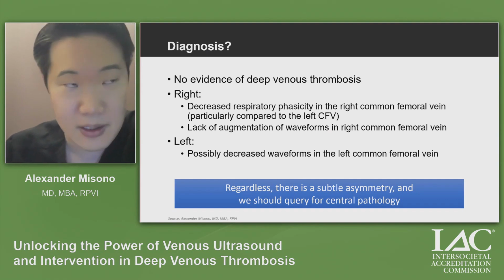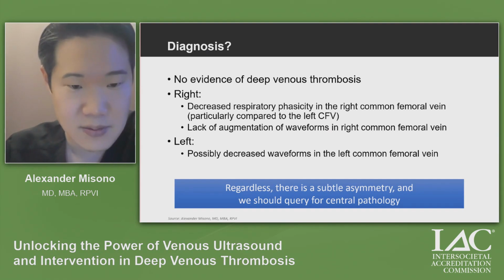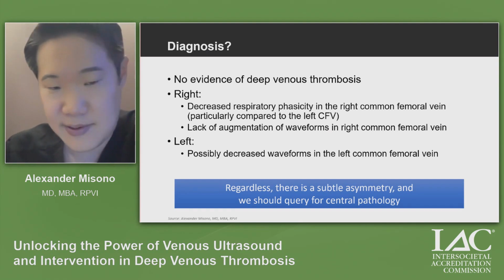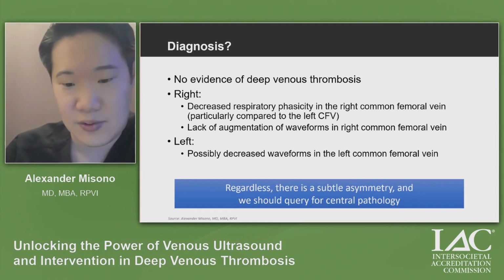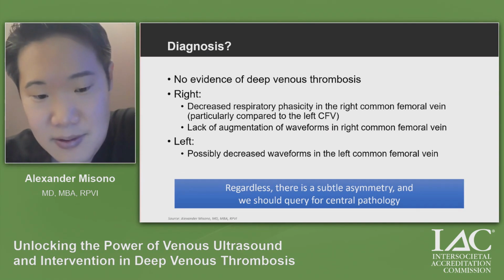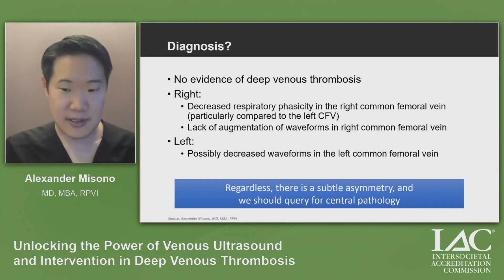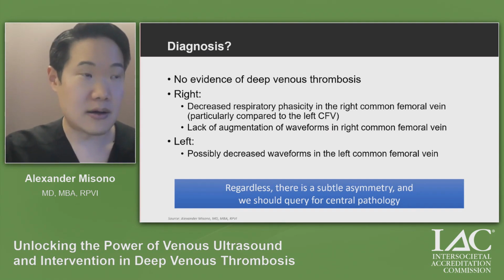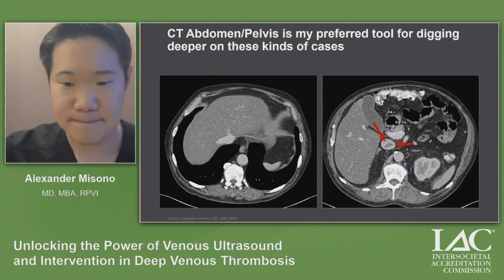I don't think that should be buried in a preliminary report or not mentioned. I think that should be surfaced to the imaging physician to finalize the report and say there are flat waveforms, this is abnormal. We need to come up with a differential diagnosis for what that is. But in this case, it's simply a subtle asymmetry. For me, that subtle asymmetry, albeit uncommon, I believe should raise a query for central pathology.